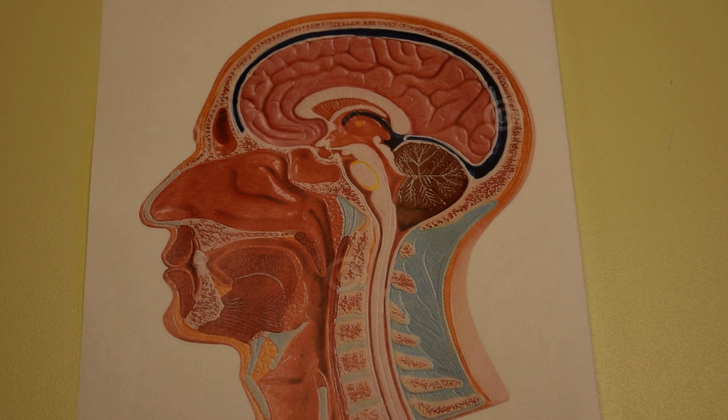The number one absolute most important tip that I can give to anyone is to clearly communicate to your patient what you're doing as you are doing it, and give them lots of time to process that information. An NG tube insertion does not have to be a rapid race. It can be done slowly and should be done strategically, and it should be done in stages. And I'm going to demonstrate what I mean by that.